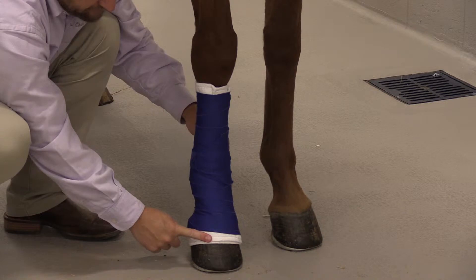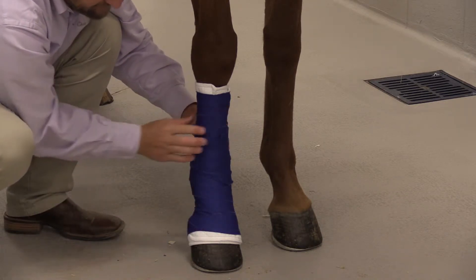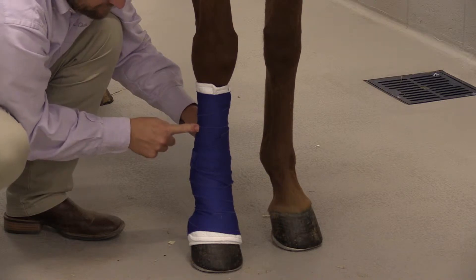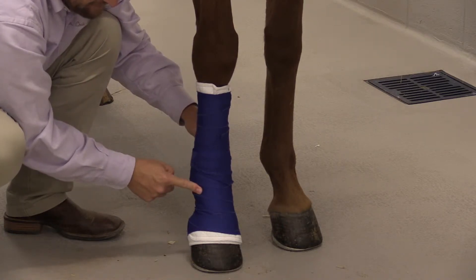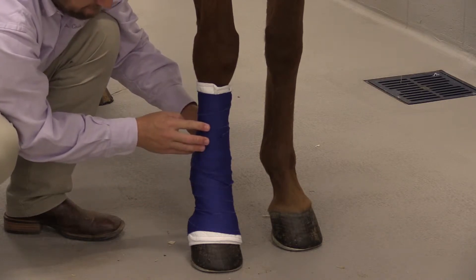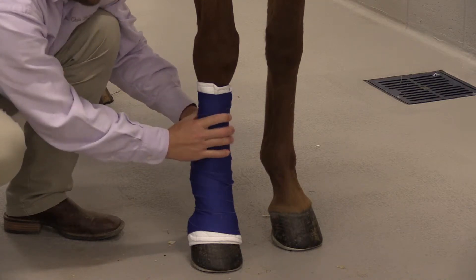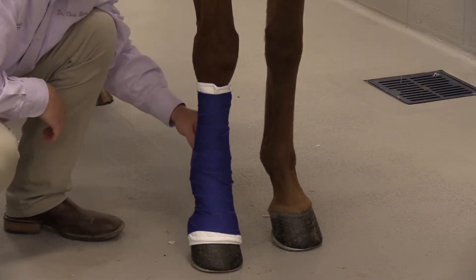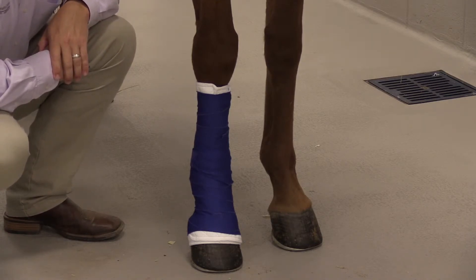Replacement of this wrap should be similar to that of disposable wraps — sometimes every one to three days. Consult your veterinarian on replacement schedule. Always if the wrap looks loose and is moving around the horse's leg, call your veterinarian and potentially re-wrap the leg at that point.